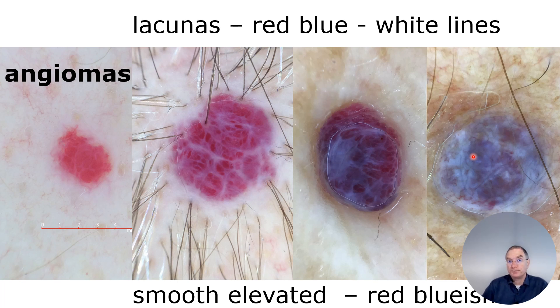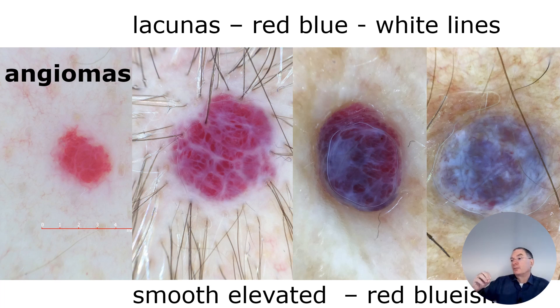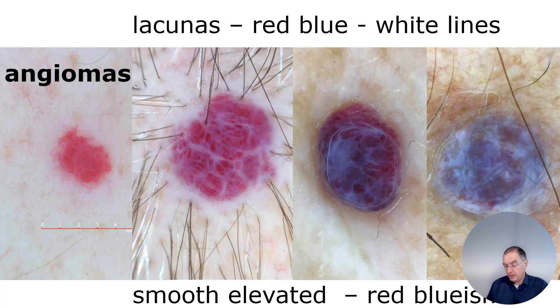The most important differential diagnosis, especially here on the right hand side, is always to think about and to exclude the melanoma — the nodular dermal melanoma. From the dermoscopic features, the pattern here is regular and homogeneous. Considering the white lines, yes, but it is regular and homogeneous. In a dermal melanoma or even metastasis, it would show a different pattern of melanoma which you have seen before and will also see in the future.